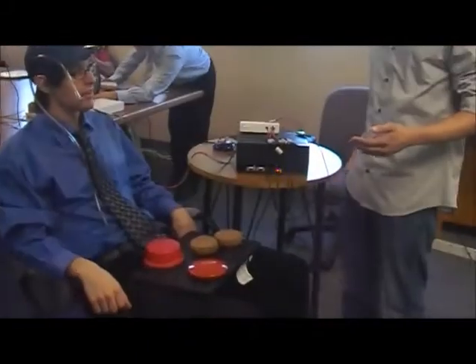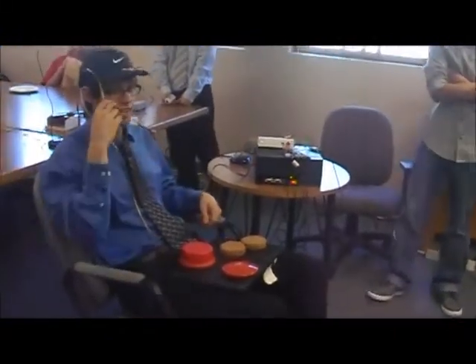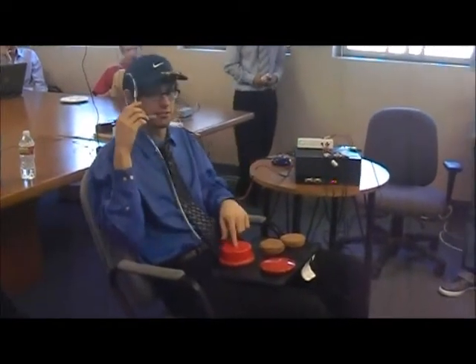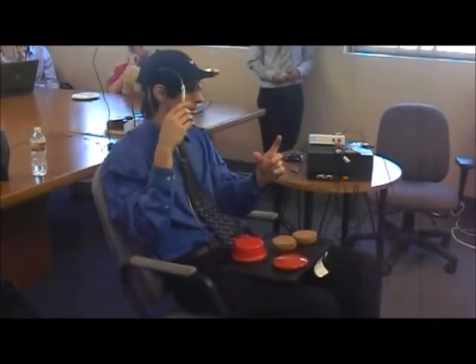Craig is going to demonstrate playing Wii bowling with our system. I have a puff sensor right here, and basically when you blow into the puff sensor, it closes the switch — it's the equivalent of pressing down a button. For bowling, you'd normally hold down the B button, the trigger button on the back.